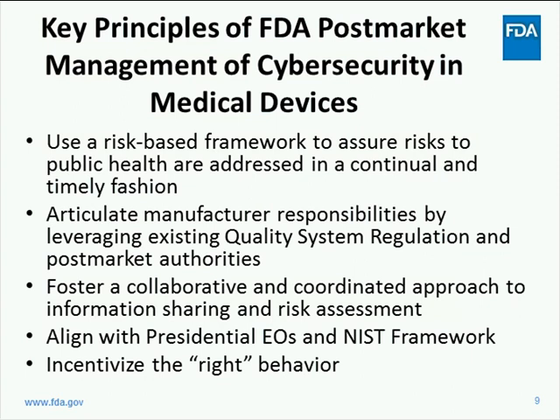Secondly, we articulate the manufacturer's responsibilities by leveraging existing quality system regulation and FDA's post-market authorities. Third, to continue to foster a collaborative and coordinated approach to information sharing and risk assessment. And fourth, to maintain that close alignment with the executive orders and this framework.